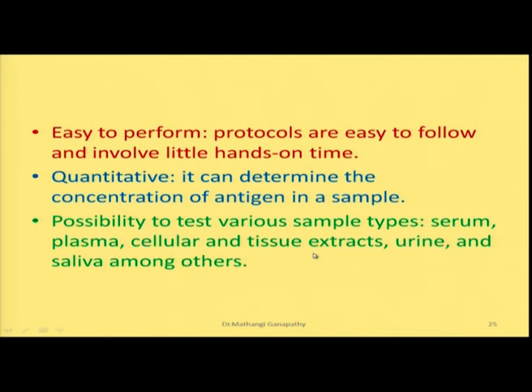So, this is a normal technique which is used not only for the clinical diagnosis of pathogens, but it can also be used to detect pathogens from food. If you suspect food poisoning, you can also detect the presence of the toxins concerned from that person's saliva or urine.